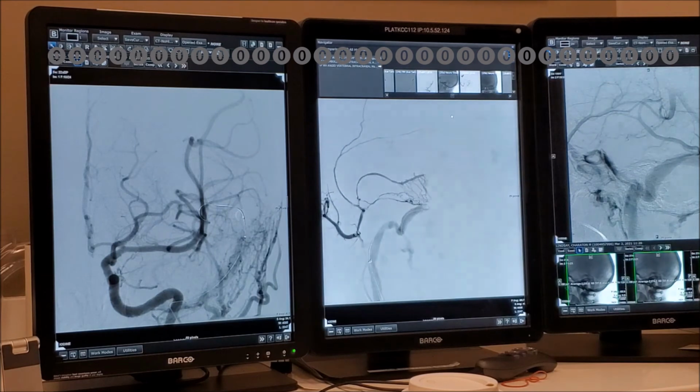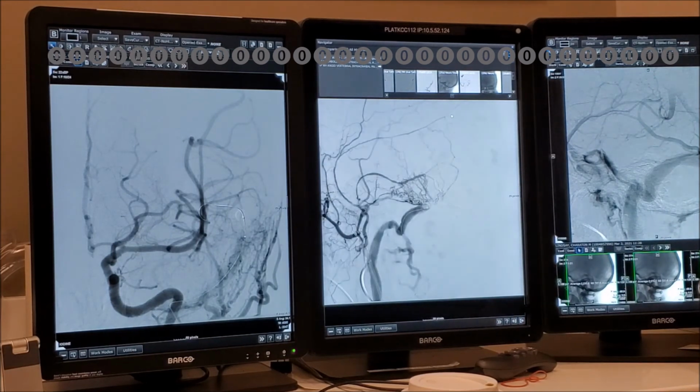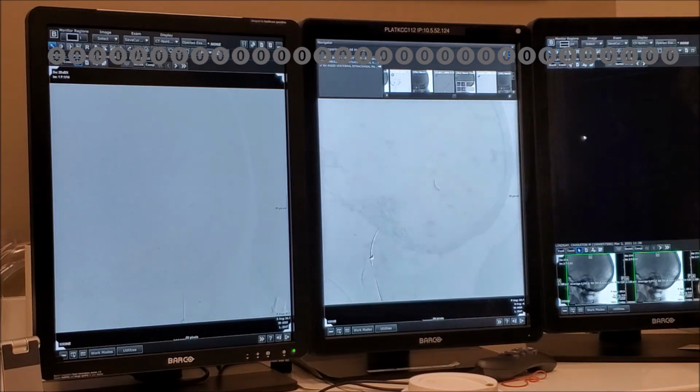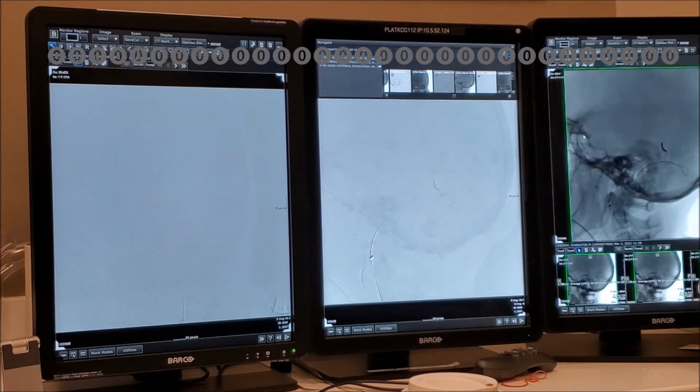So that's after the initial embolization. You can see that small distal branch from where we embolized there. So we went out with a Septa 4x10, coiled off that branch, and then proceeded to do another embolization from that distal parietal division. Again with transvenous balloon protection of the sinus.